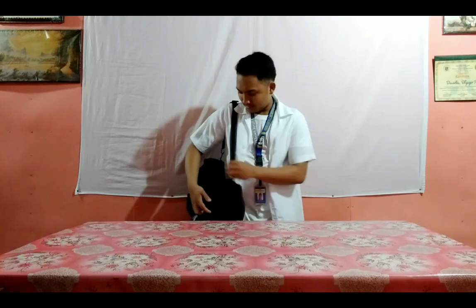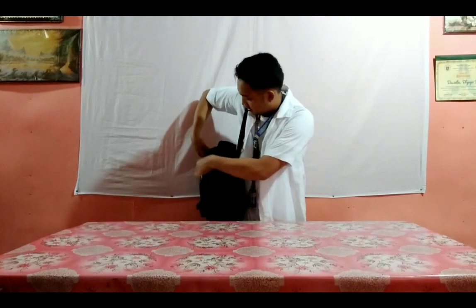Instruct the client to urinate. Gather the specimen using clean container. Ma'am Mary, I have here a clean container. Can you please urinate and put a sample of your urine here in a clean container? We have our comfort room over there. Assuming that the client has already urinated.